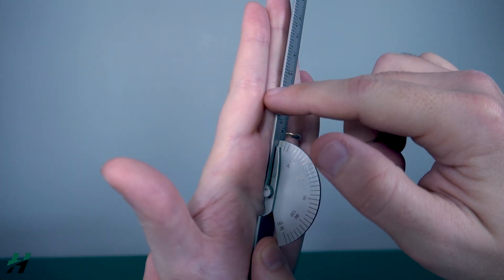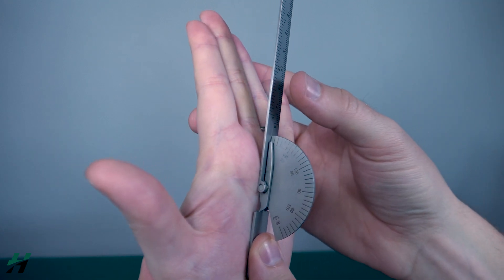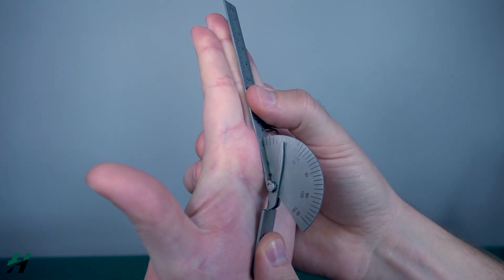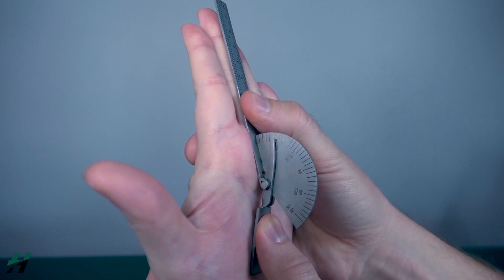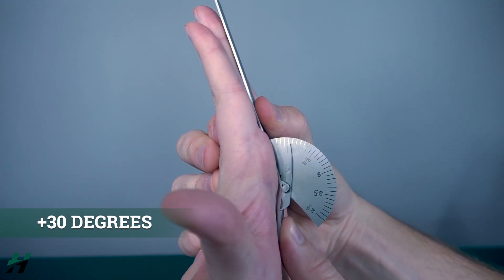Rachel, I want you to extend your hand backwards as far as you can go. Right on there — we're looking at 30 degrees of hyperextension.